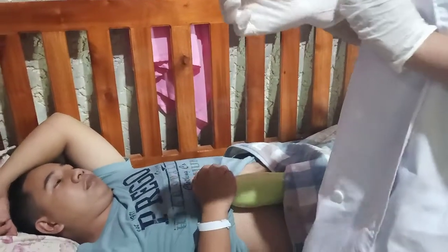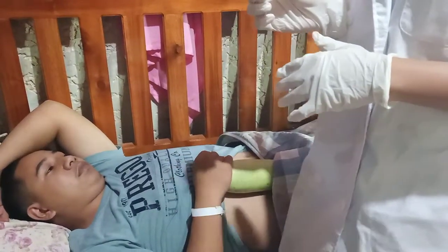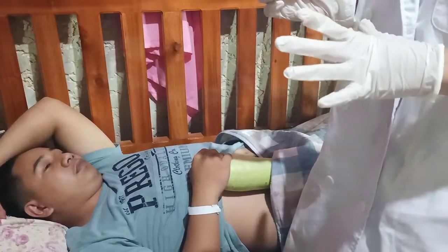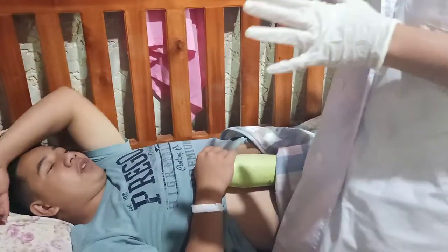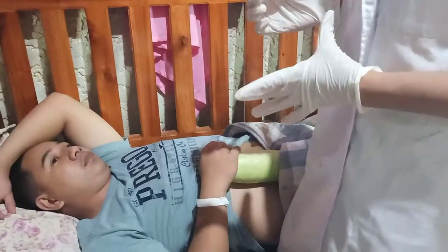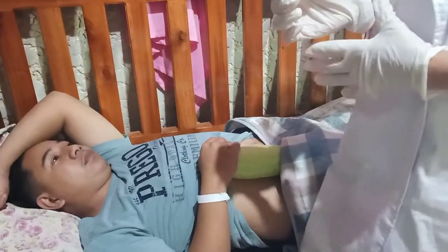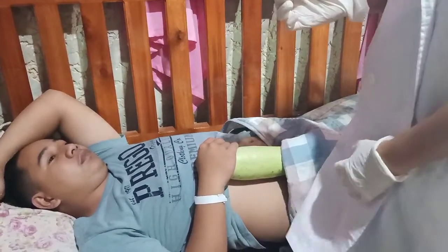And insert the needle quickly and firmly at a 45 to 90 degree angle. Pain is minimized by inserting the needle without hesitation. Release the patient's skin.